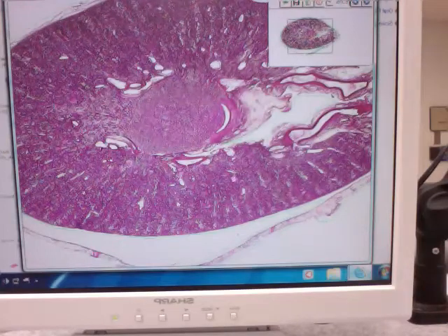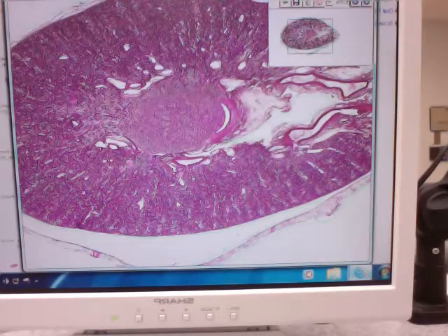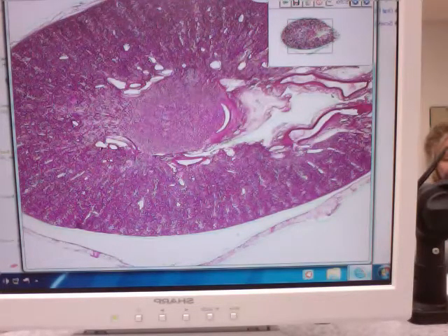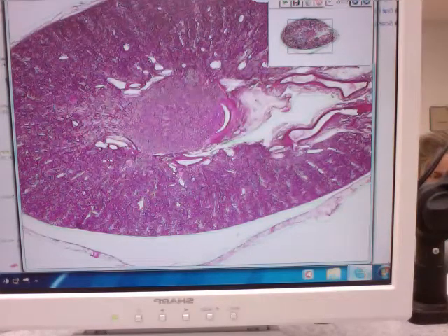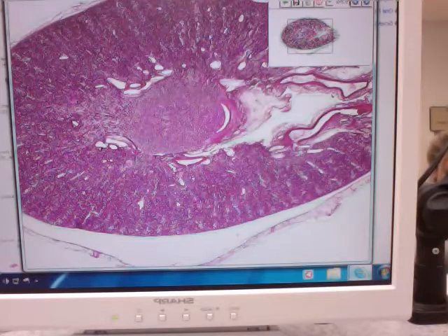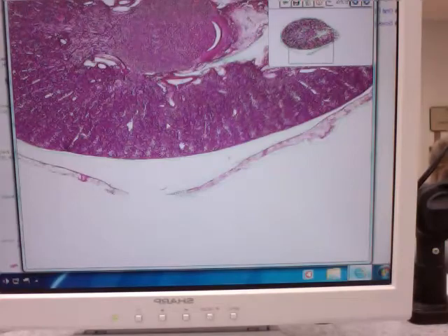I think everybody should be okay with that. So, actually as I go through some of the organs, I'll pull up certain things, and as you review things, you should be able to do both epithelium and connective tissue, do as many of the tissues that you can see in the slide as possible. So it'll be easy for us to maybe do multiple things as we're going through some of the slides. So let's get going.